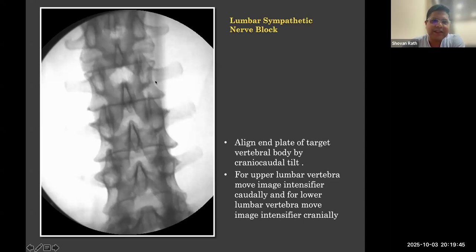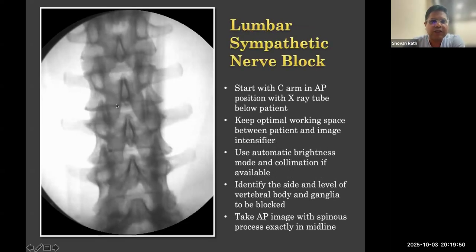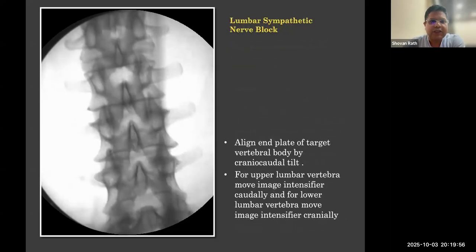So just imagine this is the bone now. Just before, this is what L2 was, and the lower border was not squared. Now we make a little bit of tilt, and see, the lower border is squared. Now these are the pedicles. This is the spine. This is the body of the vertebra. And these are the facet joints, on both sides. These are the transverse processes.